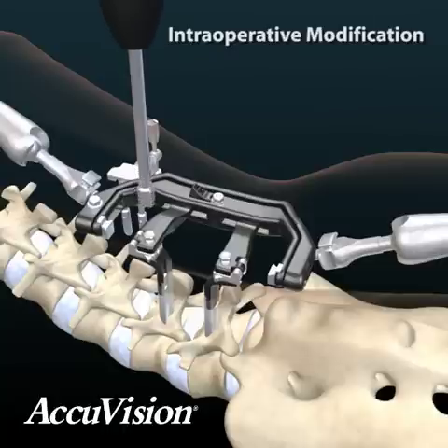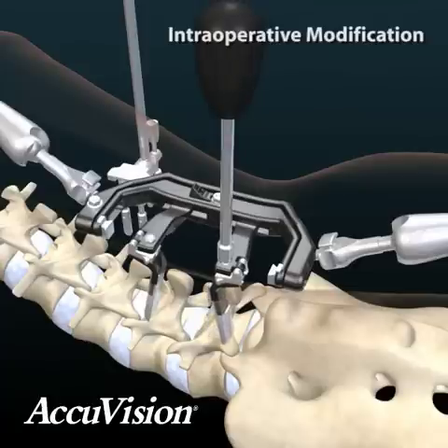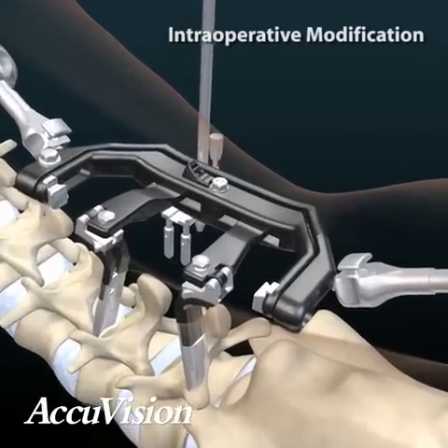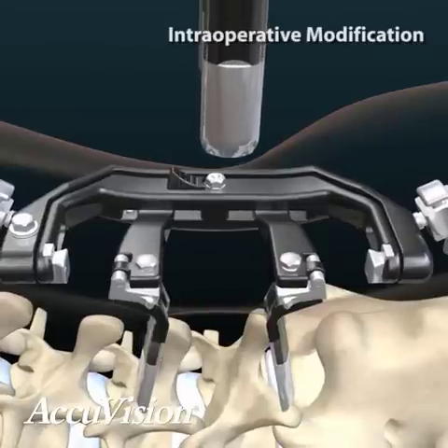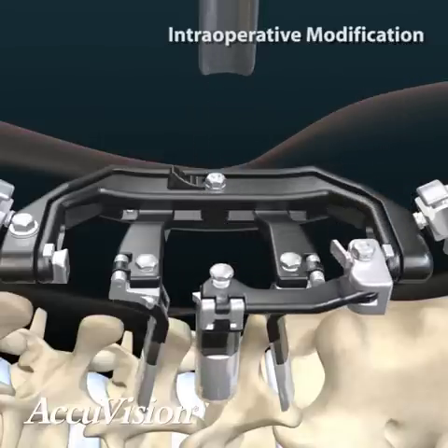Additional retraction of soft tissue in the surgical site can be achieved by angulating out the distal end of the individual blade. Place the hex wrench on the hex nut of the retractor arm and turn in a clockwise rotation. The lateral retractor arms are secured onto the dovetail connections at the distal ends of the retractor frame. In the non-extended position, the retractor arm will fit into the surgical site.